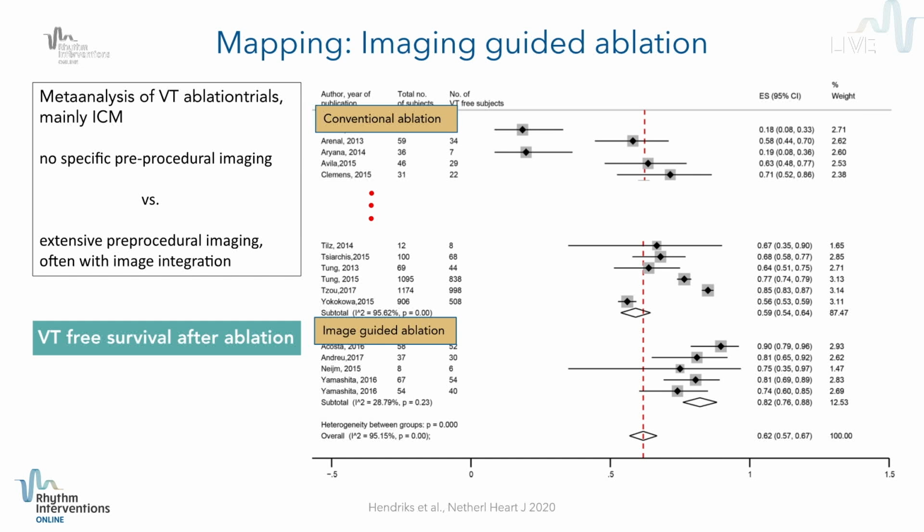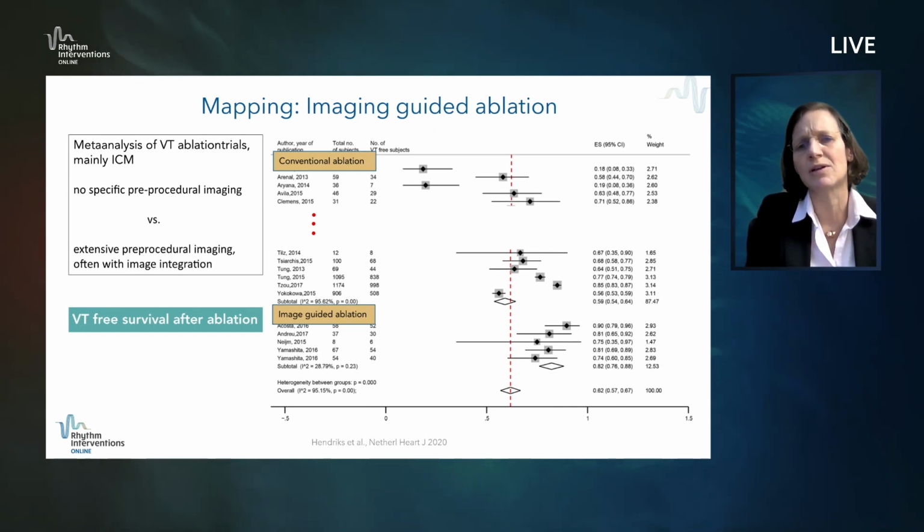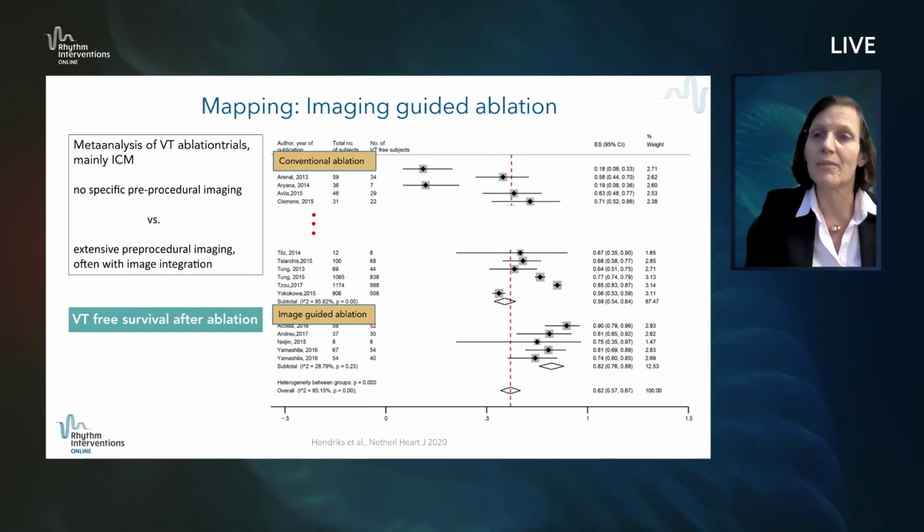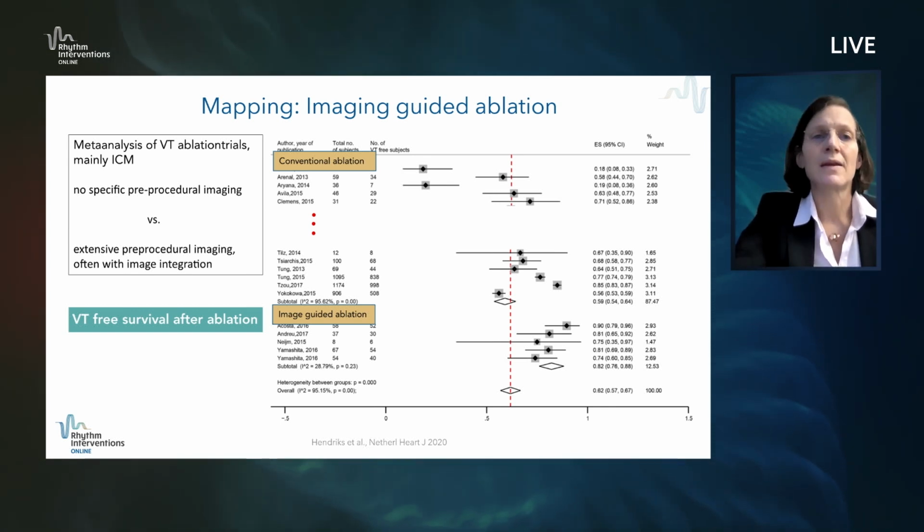And I think that's one of the lessons that we learned. You cannot have too much imaging in VT ablation. You can only have not enough. And so it really impacts also a hard endpoint like the VT-free survival after ablation. So you're asked to do it.